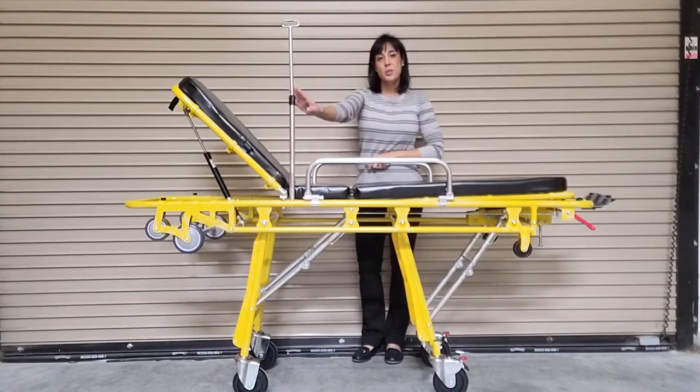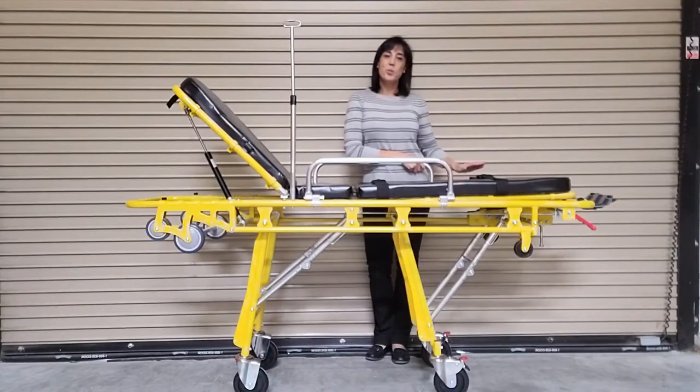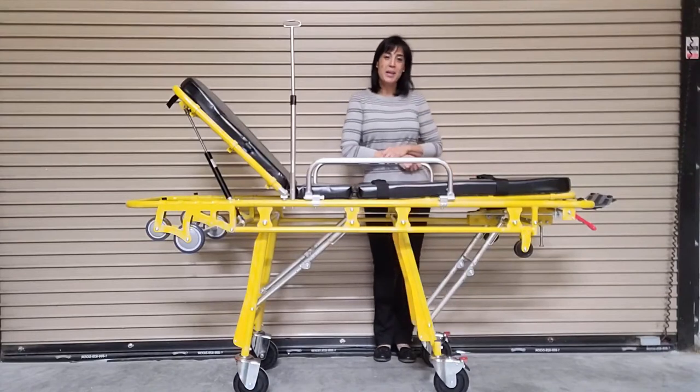This unit also comes standard with an IV pole and an O2 holder, as well as two patient safety restraints and two locking casters to keep the stretcher in place.